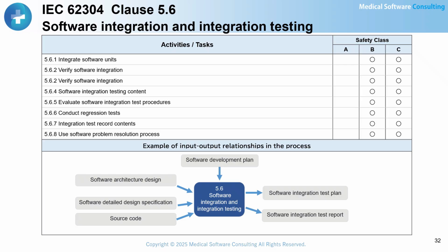When integrating a software item into an already combined set of software units, regression testing should be carried out as appropriate. This demonstrates that no new defects have been introduced by the integration. The results of these tests should be recorded in the Software Integration Test Report.